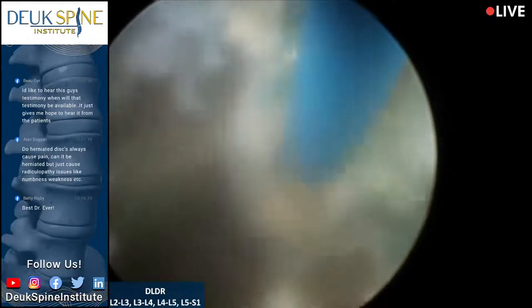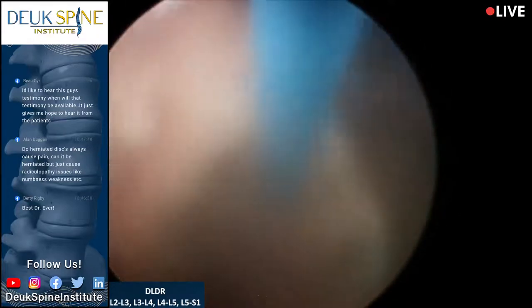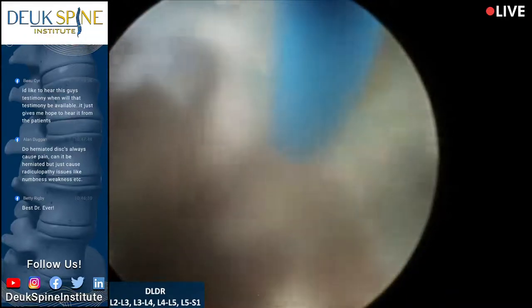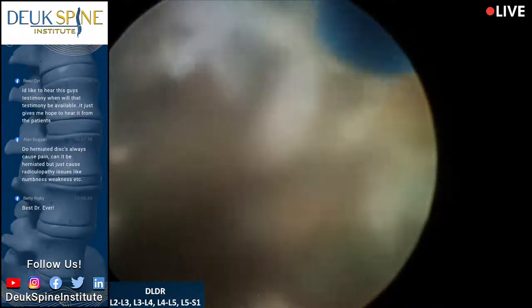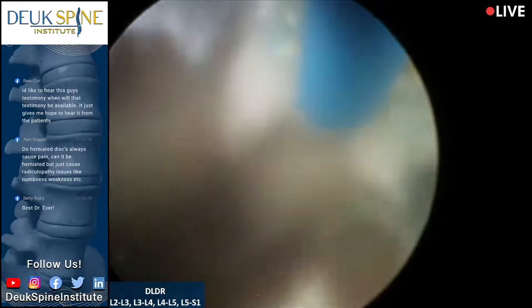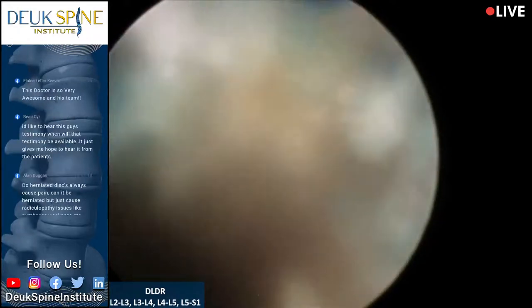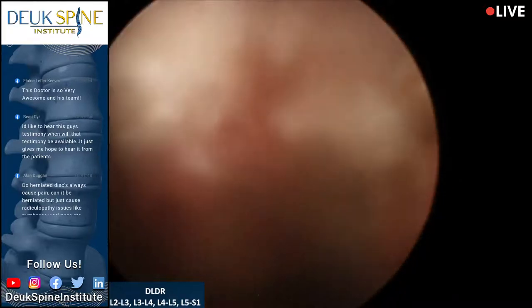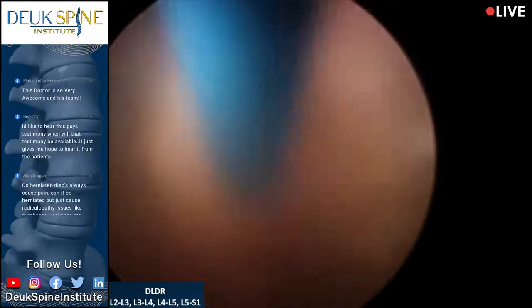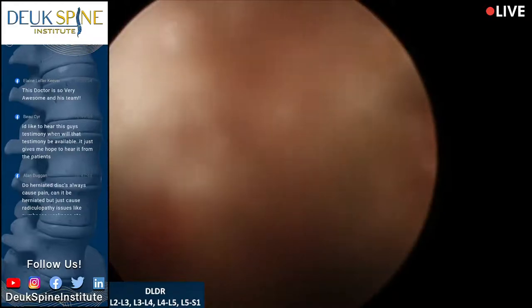This is a lateral herniation right here I'm working on. I'm just using this laser to break up the herniation into smaller pieces. Again, I apologize for the poor quality of imaging, but that's just a little bit of blood. All right. Back to the medial portion where the pain comes from.